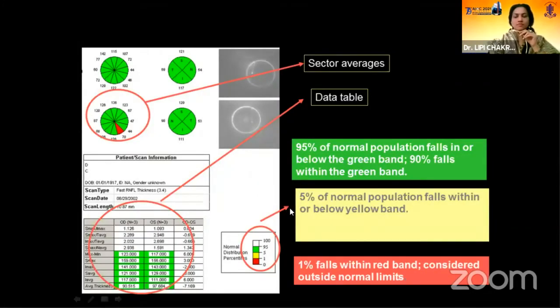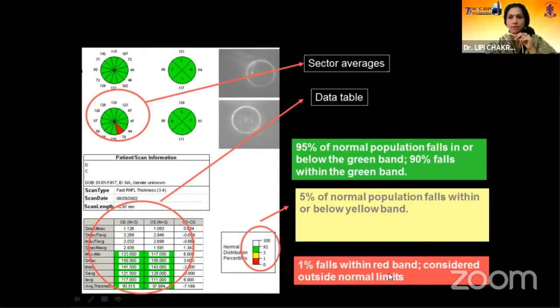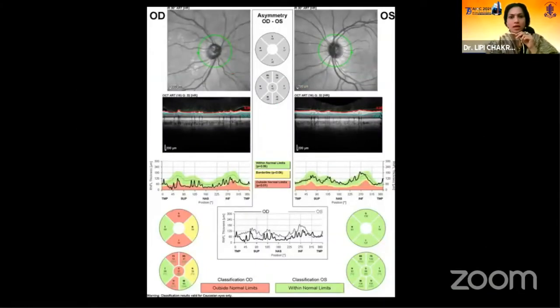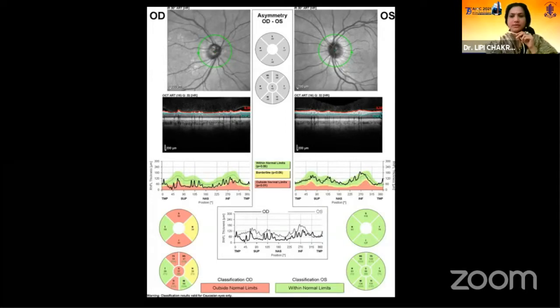Percentile color coding — one percent of normals fall within the red band, so this is considered outside normal limits for most of the population. But we should remember that one percent do fall within this red zone. This is the corresponding RNFL analysis on another machine, the Heidelberg Spectralis.